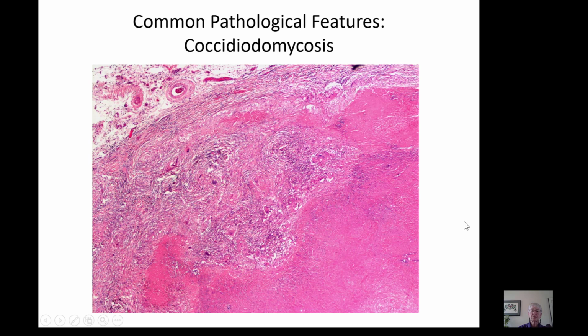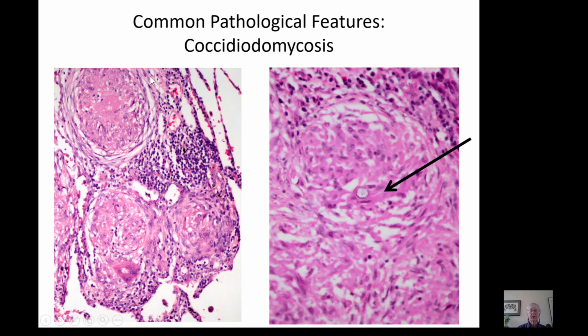Here's coccidioides. So you saw the dense granulomatous reaction of coccidioides, and here is one where there is actually marked necrosis, with along the periphery of the necrosis poorly formed granulomata and multinucleated giant cells. In this case, coccidioides has a definite granulomatous reaction with relatively well-formed granulomata, and when you look at these granulomata, you can find the coccispherules with the endospores present within the spherule.